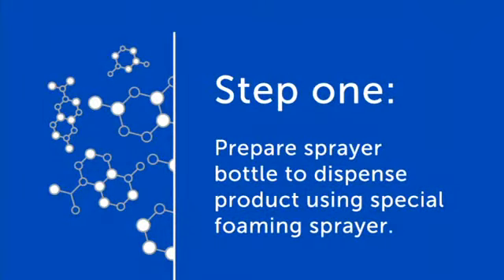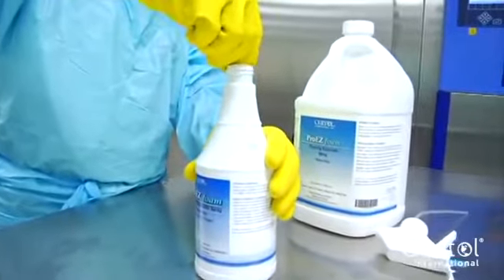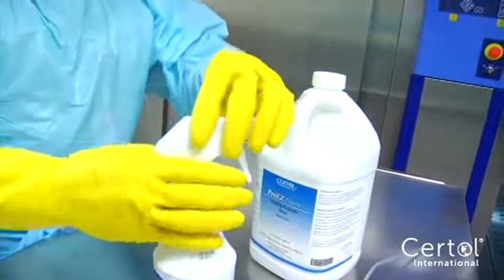Step 1. Prepare sprayer bottle to dispense product. ProEZ foam is shipped in 24-ounce bottles with a leak-resistant induction sealed cap. Remove the induction seal, insert the uptake tube of the spray head, screw spray head on.